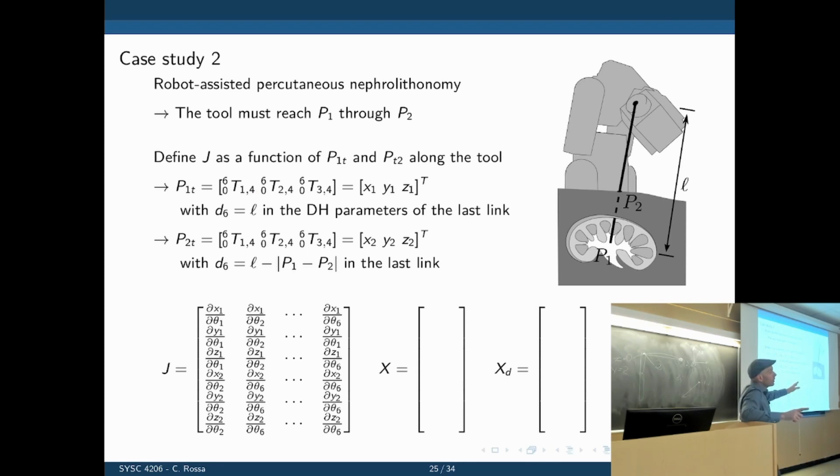first. But that doesn't guarantee our success here because we want to pass through P2. So what's the second constraint? The location of P2, like the entryway, is the distance between P2 and the corresponding P2 on the tool shaft.